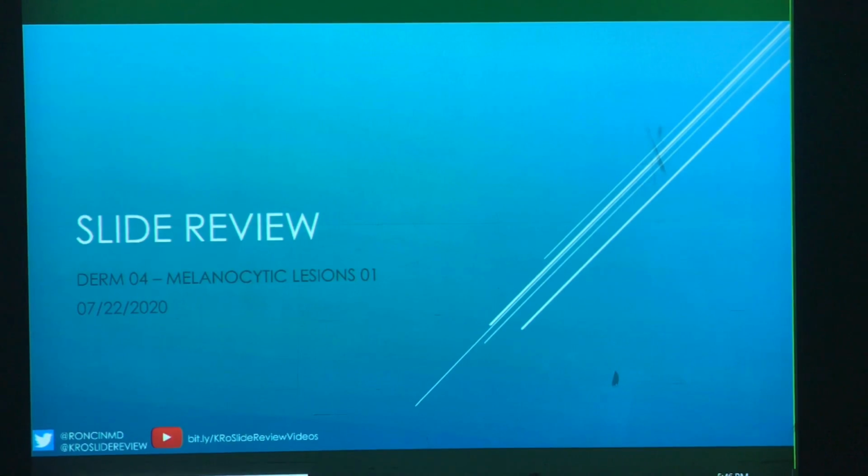Welcome to Slide Review. Today we are taking a last look at some Dermatopath with melanocytic lesions.